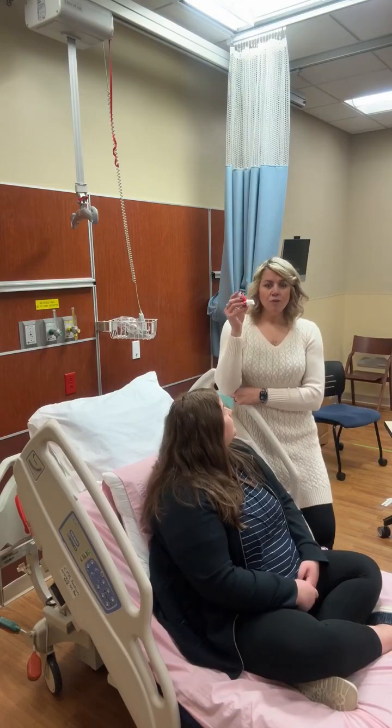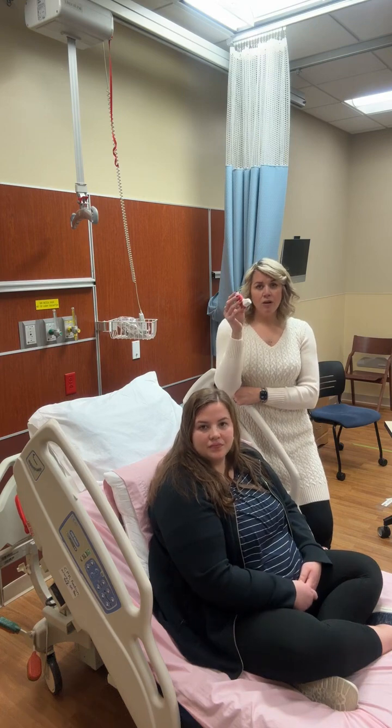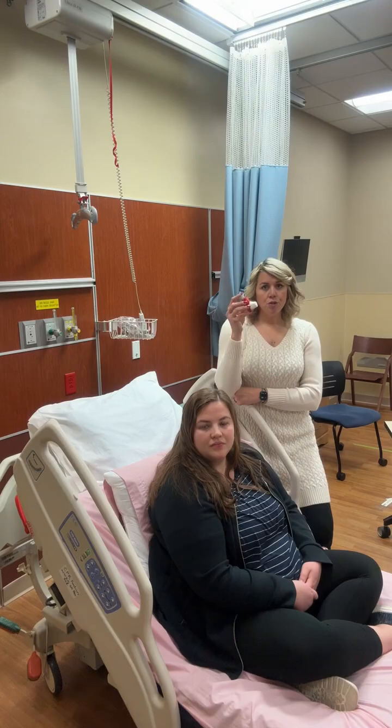Some of your simulations will have albuterol inhalers as an ordered medication that you have to provide to the patient and educate them on how to use.